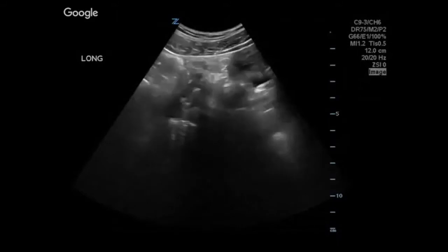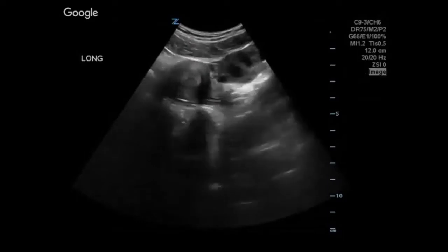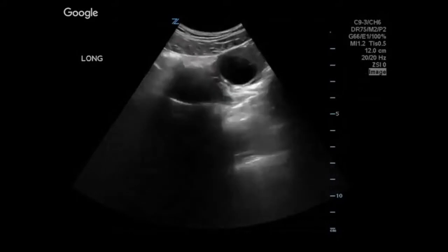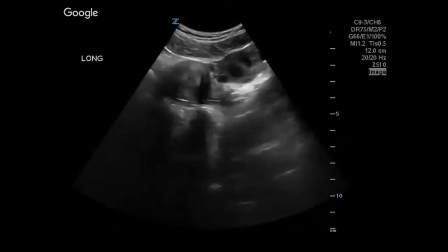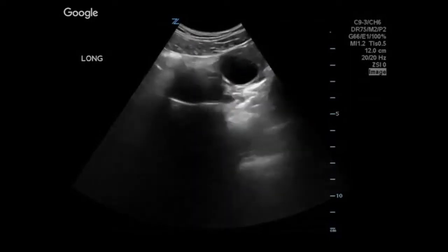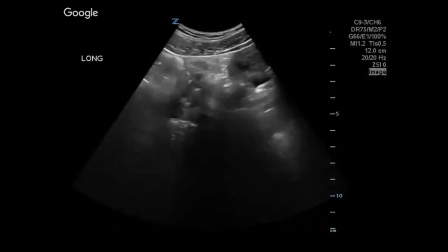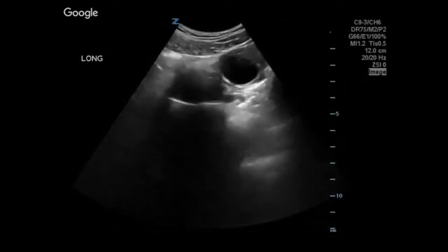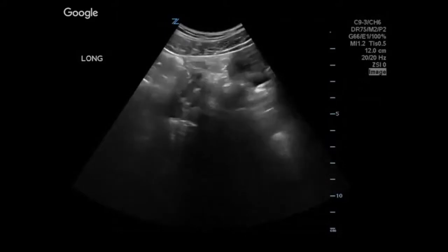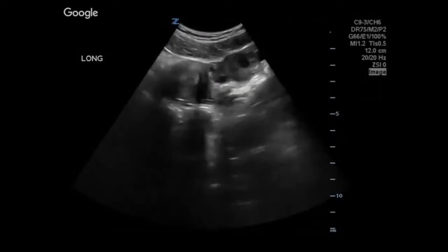I mean, it says long. I don't know. Could it be the uterus, but it's actually transverse? But then if it's not, it's still vagina. That's what a gestation sac might look like, but that's not a uterus. Where's the bladder? Yeah, I don't know. So there's no bladder. That's not uterus. So what is it?